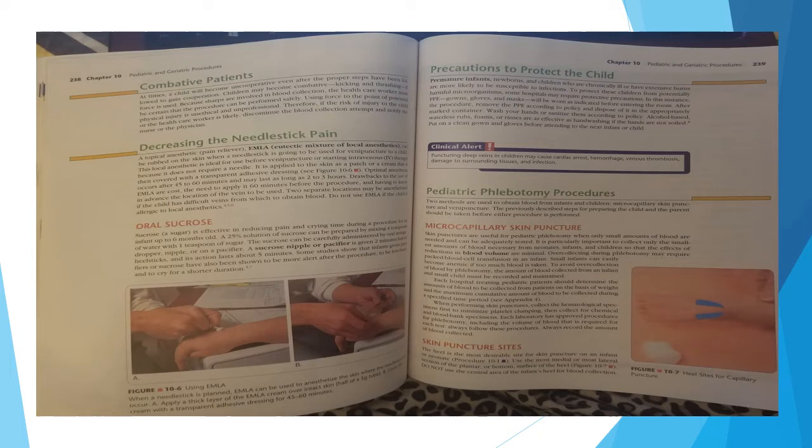Clinical alert. Puncturing deep veins in children may cause cardiac arrest, hemorrhage, venous thrombosis, damage to surrounding tissues, and infection. Pediatric phlebotomy procedures. Two methods are used to obtain blood from infants and children: microcapillary skin puncture and venipuncture. The previously described steps for preparing the child and the parent should be taken before either procedure is performed.